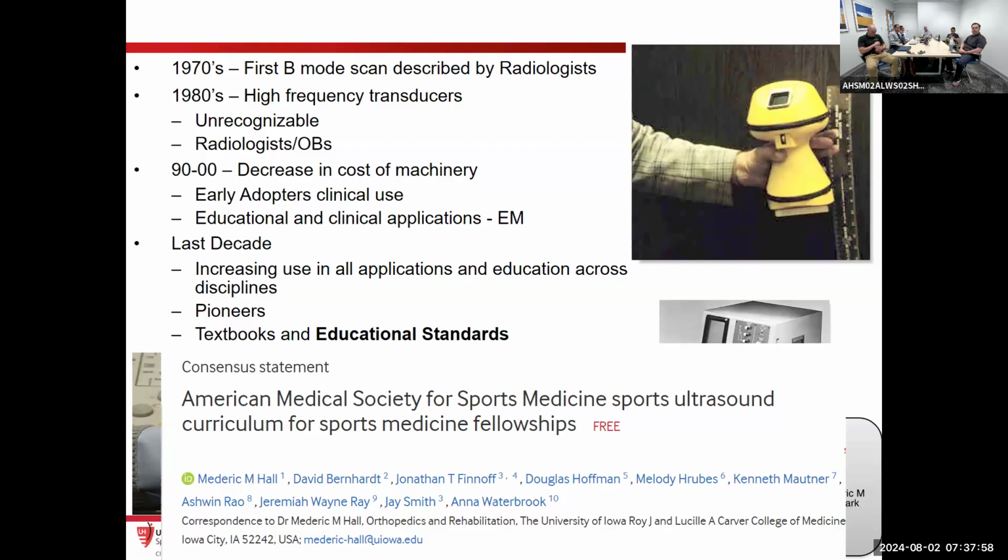They pitted first-year medical students against cardiologists, all of whom had 15 years' worth of experience. The medical students were given ultrasounds and about a 90-minute crash course on how to evaluate the heart on ultrasound, and the cardiologists were given their stethoscopes. And then they were told to make diagnoses on these 100 people.